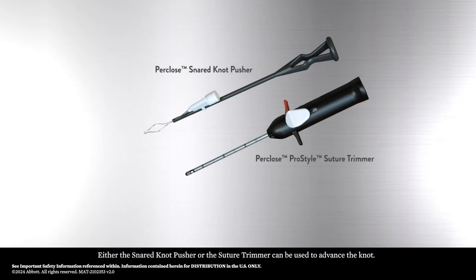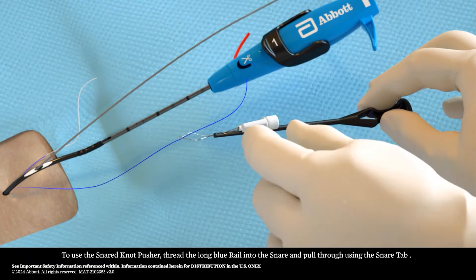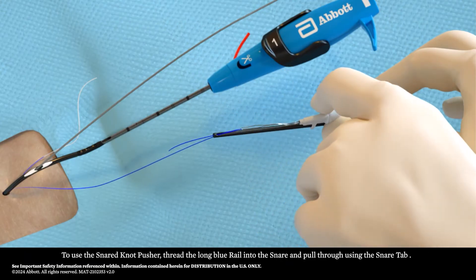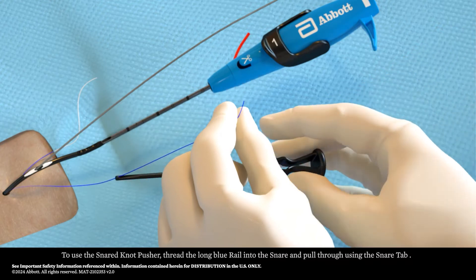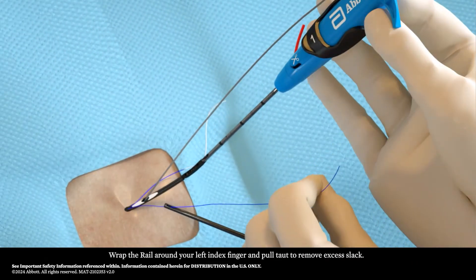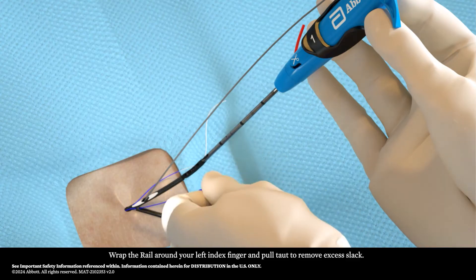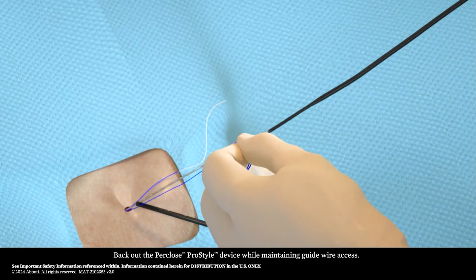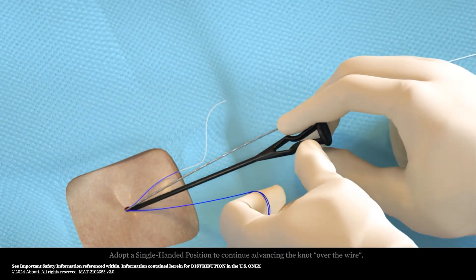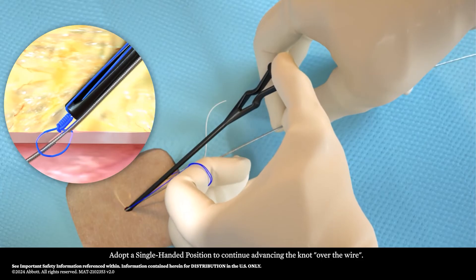Either the snared knot pusher or the suture trimmer can be used to advance the knot. To use the snared knot pusher, thread the long blue rail into the snare and pull through using the snare tab. Wrap the rail around your left index finger and pull taut to remove excess slack. Back out the Perclose ProStyle device while maintaining guide wire access, then adopt a single-handed position to continue advancing the knot over the wire.